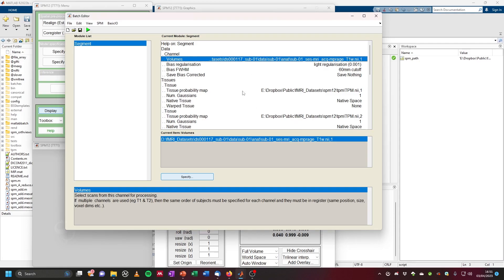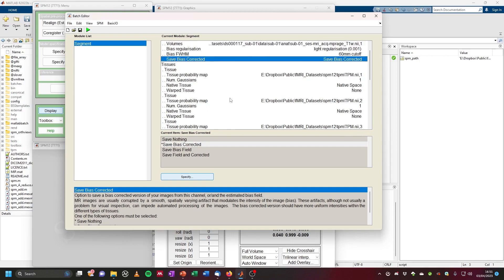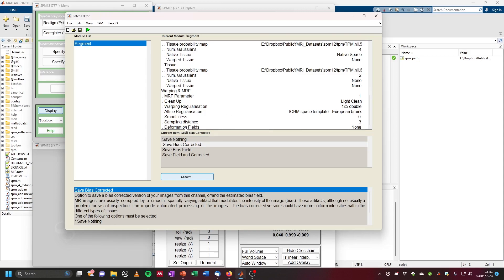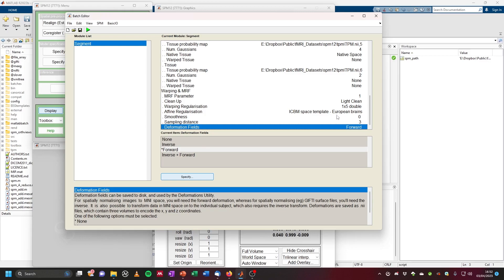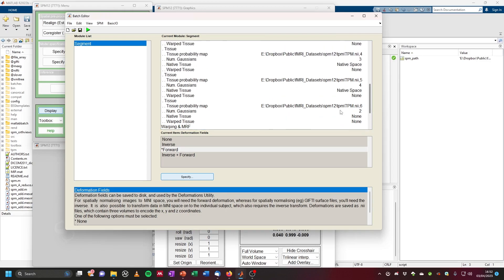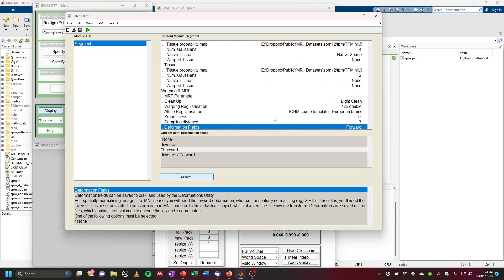The default options are pretty good, but two things I like to change: first, save the bias corrected image — click here and choose save bias corrected instead of save nothing. Then navigate down to the bottom, and under deformation fields, save the forward field by clicking forward. This is the deformation field we want to later use to transform our functional images into MNI space. In this segment step, SPM uses tissue probability maps in MNI space to calculate a deformation field to transform the structural image into MNI space.